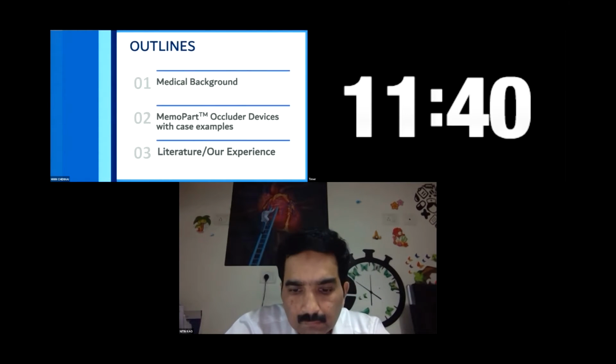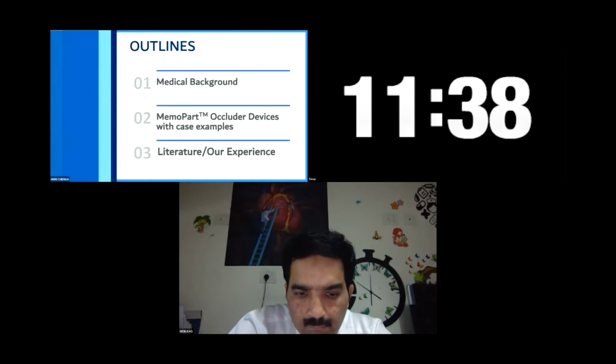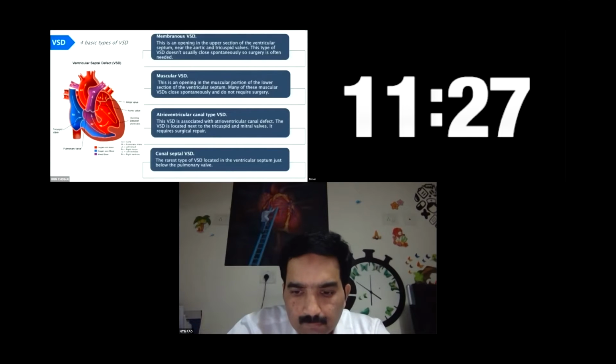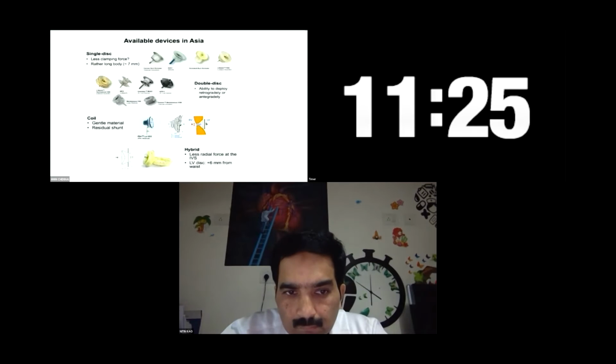So mainly talking about the medical background of these various VSD occluders, and I'll illustrate each occluder with some examples and literature and with some of our experience in our own cath lab. Due to shortage of time, I'm not going to detail these types of VSDs because all the people are aware of the VSDs.